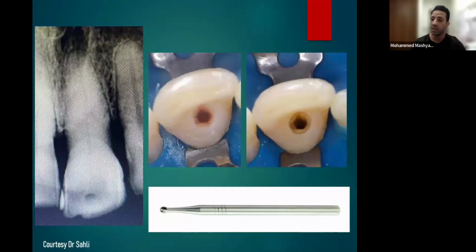Here, one of my students and one of my employees now, he worked with us. He is a general dentist, but a super dentist. This is a difficult case, very calcified. Why do I bring these cases for GPs? Because if you, as a GP, work with some good endodontist, or any specialty, he can show you good cases, and he will show you the right instrument, the right path, so you can just follow.